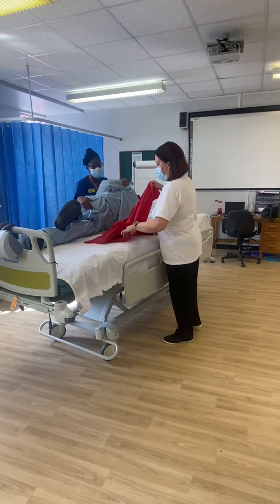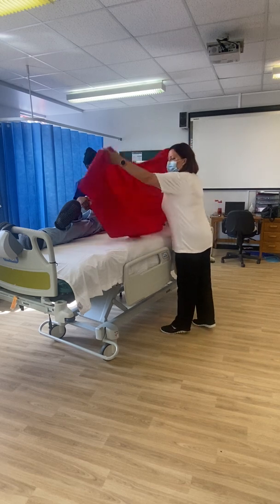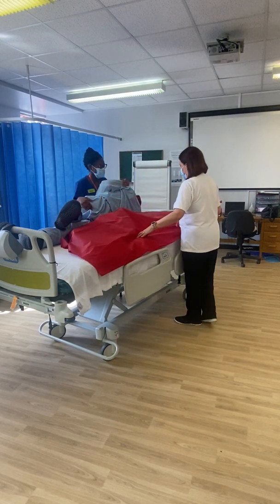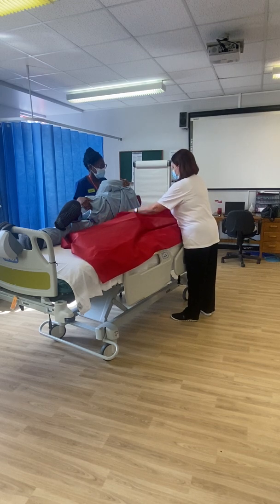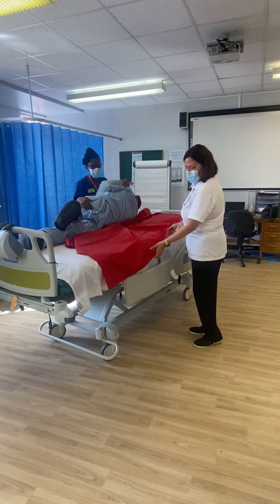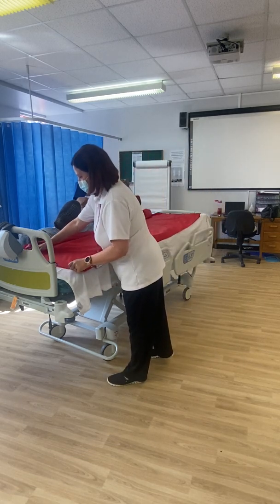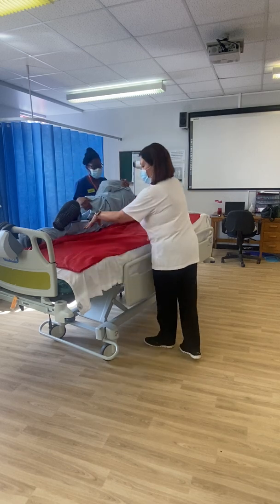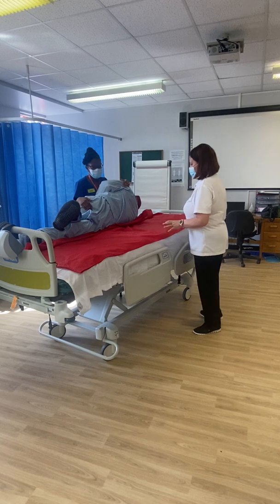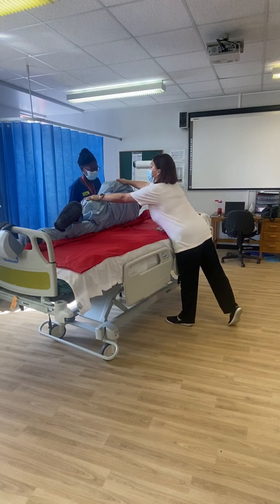We now open up our slide sheet. It's a tubular slide sheet. It doesn't matter which way out it is because it's slippery all the way around it. So with this edge level with the edge of the bed and ensuring that it goes all the way down to the feet, we're going to just tuck the other edge of the slide sheet gently underneath the patient and then roll them back. Ready, steady, go.